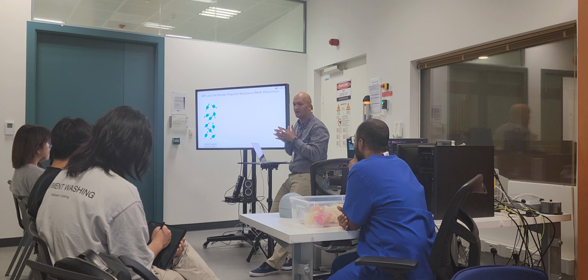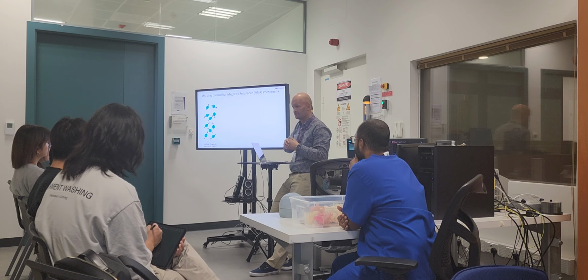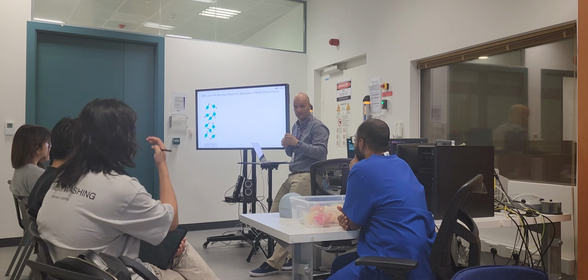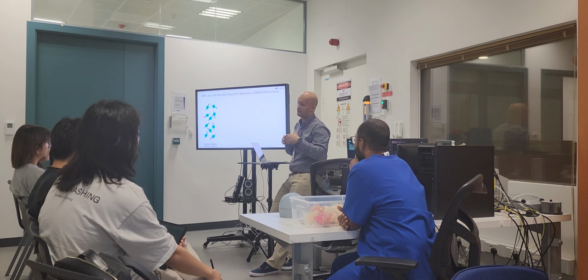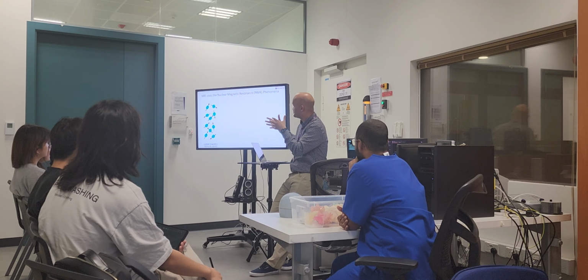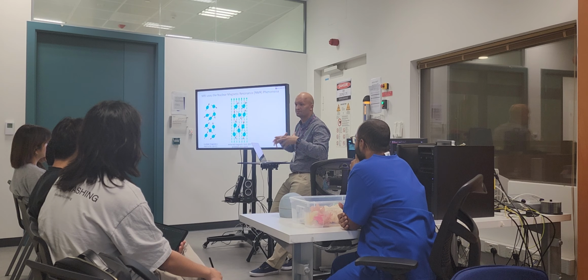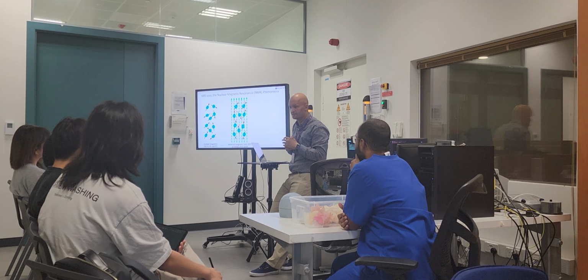It's some nuclei, not all of them. We can talk about hydrogen, carbon 13, not carbon 12, right? Phosphorus, sodium, yeah. Some nuclei have nuclear magnetic moments. If you put them in a magnetic field, I'm representing the field with blue arrows of equal length, they will pick up an angular momentum.